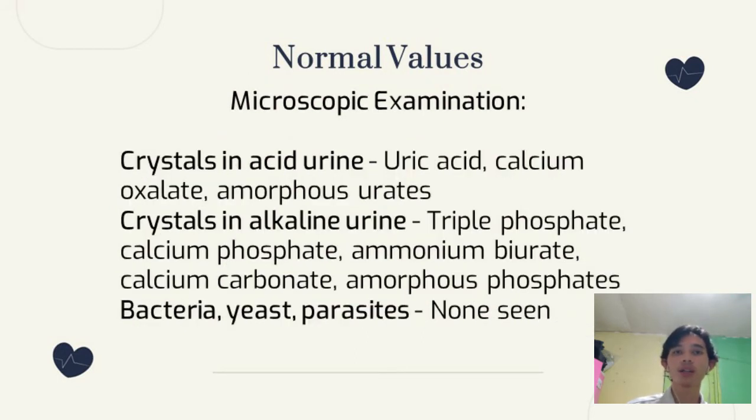Ammonium urate, calcium carbonate, and amorphous phosphates. For bacteria, yeast, and parasites, there should also be none.